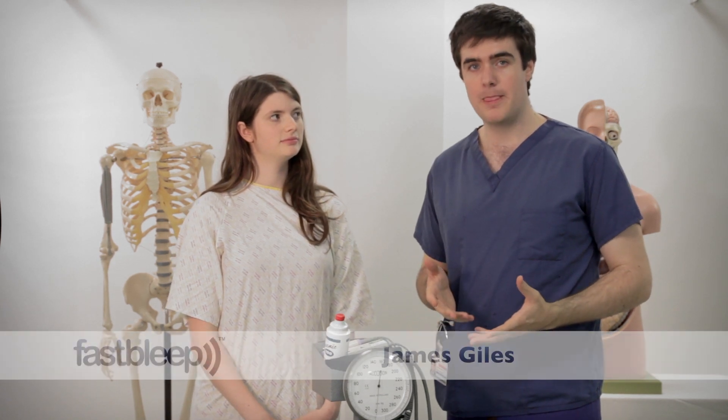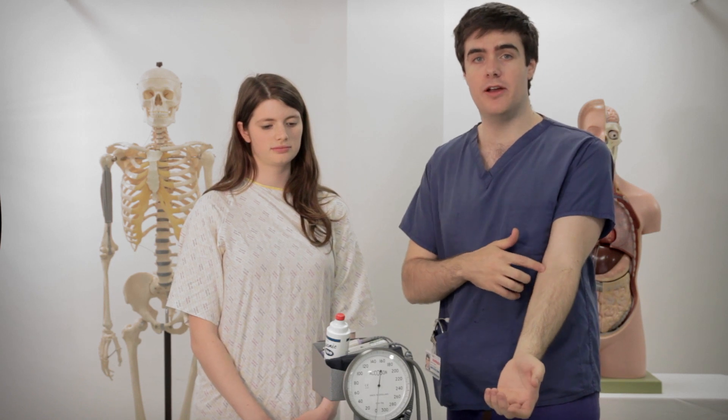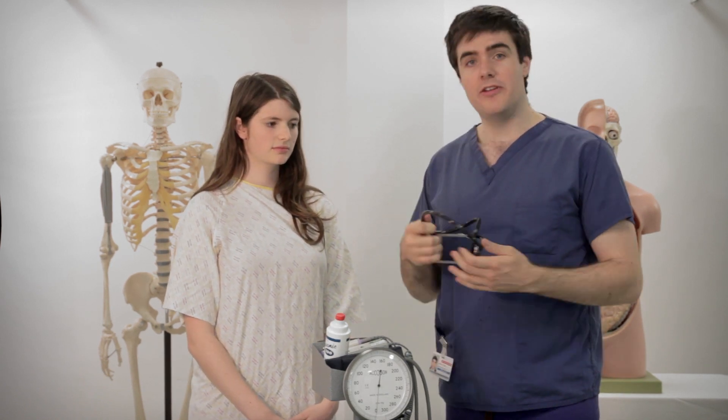I'm going to show you how to measure blood pressure now. Normally you do this with a stethoscope listening at the elbow where the brachial artery passes so you can hear it, but we're not going to do that today.